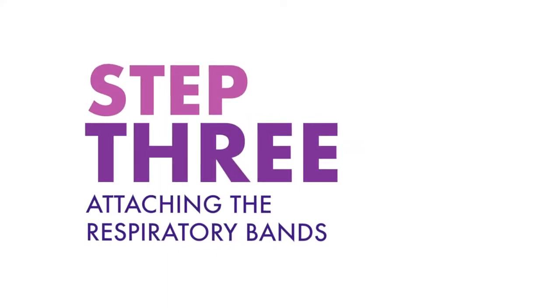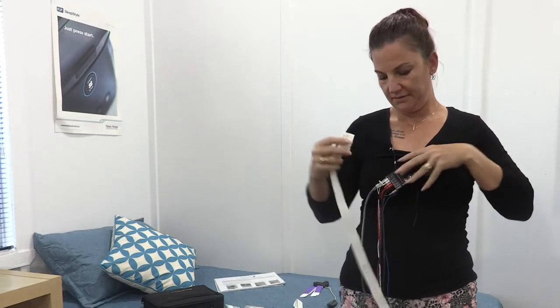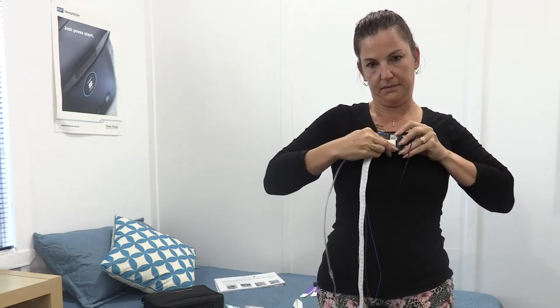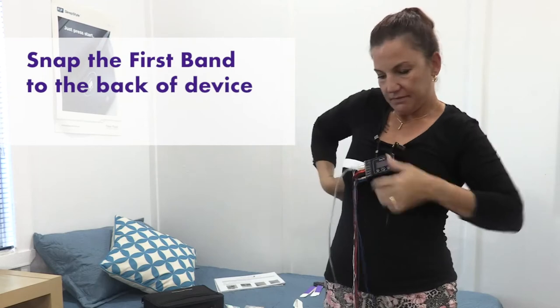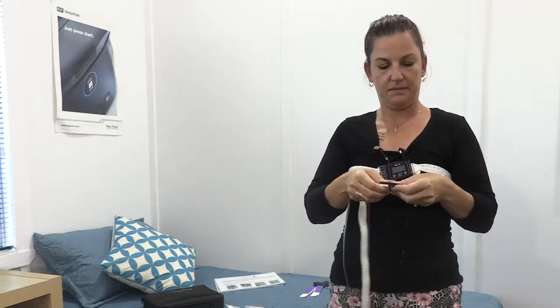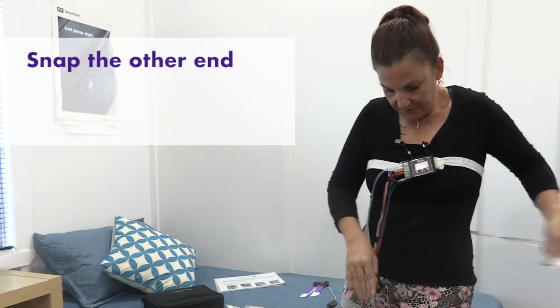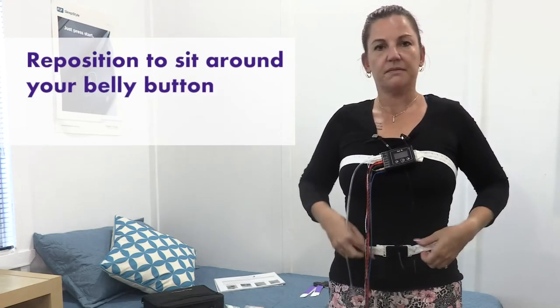Step three: attaching the white respiratory bands. These bands are used to determine how much effort you put into breathing by stretching with your chest and abdomen as you breathe. There are snap-on buttons behind the machine to snap the bands in place. Snap the first band onto the back of the device and wrap the band around your chest, above the breasts and under your arms, then snap the other end of the band to the device. Snap the second band onto the black square and wrap the band around your waist, then snap the other end of the band to the black square. Reposition to sit around your belly button. Ensure the white belts are not twisted.